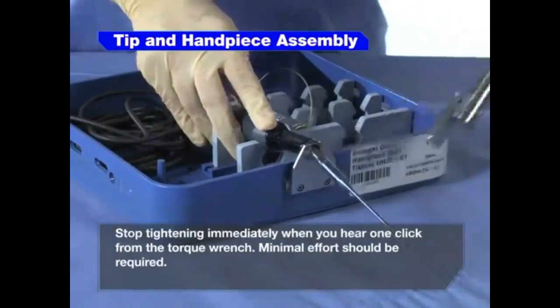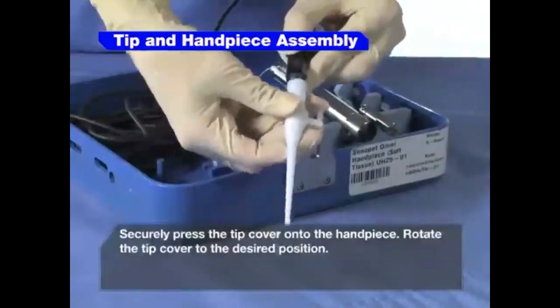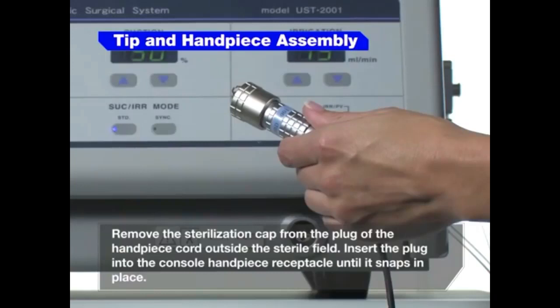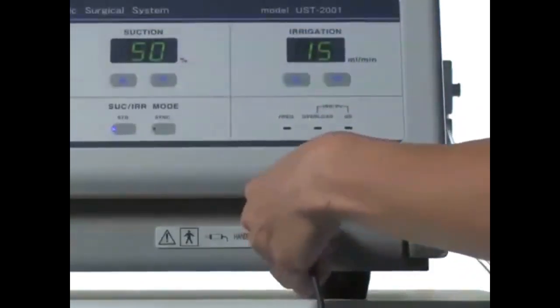Minimal effort should be required. Securely press the tip cover onto the handpiece. Rotate the tip cover to the desired position. Remove the sterilization cap from the plug of the handpiece cord outside the sterile field. Insert the plug into the console handpiece receptacle until it snaps.